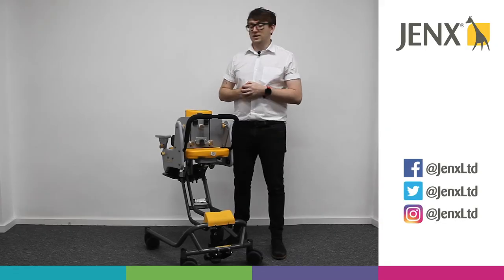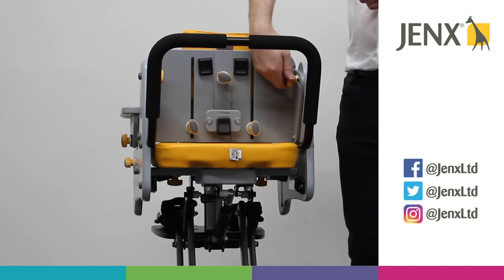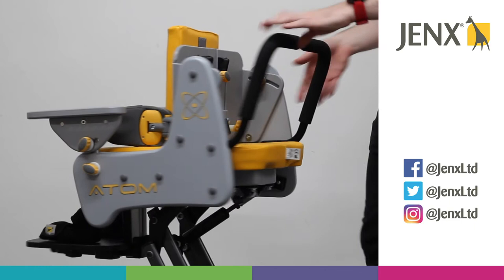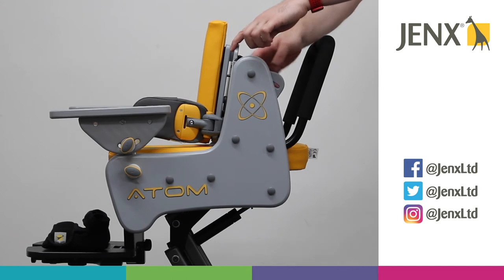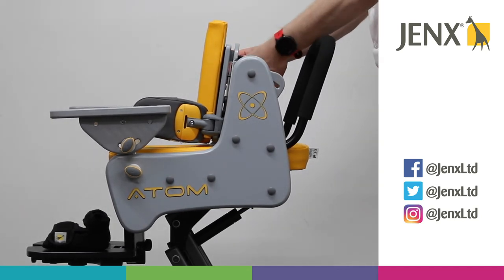Now we're going to take a look at the back angle adjustment of the Atom. We've got two wing knobs either side here. If we loosen those off, then we're able to adjust the back angle to where we need it to be. Once we've found the angle that we require, we can just tighten the wing knobs.